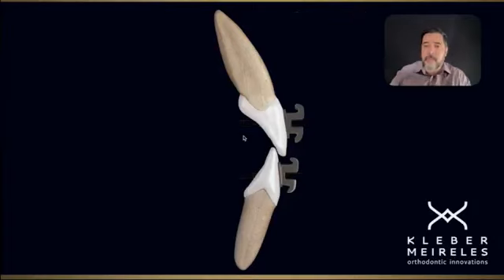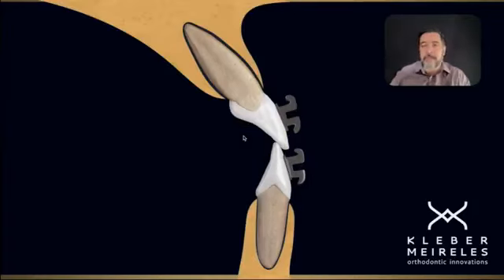So in those cases, when we have, let's say, maxillary deficiency, a little bit of a progenic profile because of the maxilla, and also because of the mandible, it doesn't matter. Of course it matters because we're going to plan based on the diagnosis, but for now, I just want to focus on the condition of anterior teeth and the contact they have. So let's say we ran the sequence of arch wires and then we reach the rectangular one, and now we're going to insert the rectangular arch wire in this condition here.